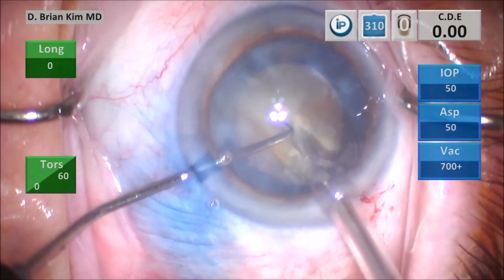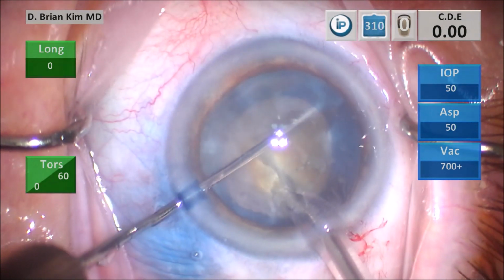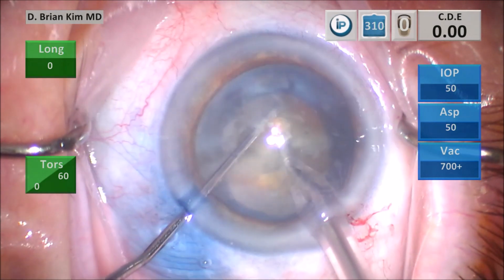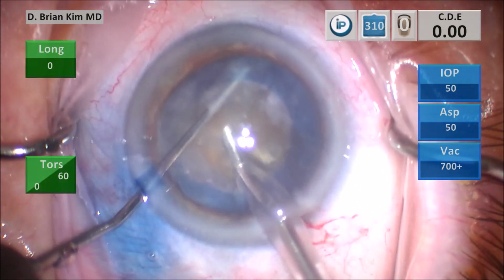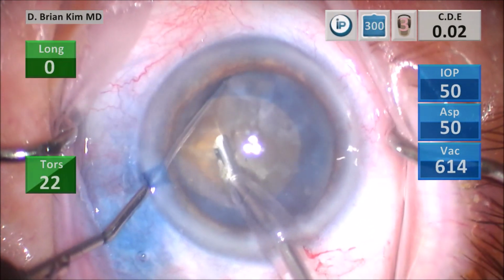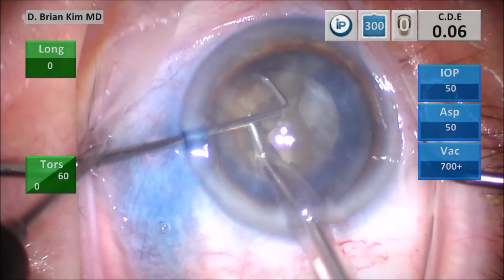I place the chopper around the right heminucleus, pulling it centrally towards the phaco tip, and then crushing and dividing the right heminucleus. You can see because the lens is so big, there are still some posterior adhesions. And so as I go, I'm going to have to break these adhesions separately.